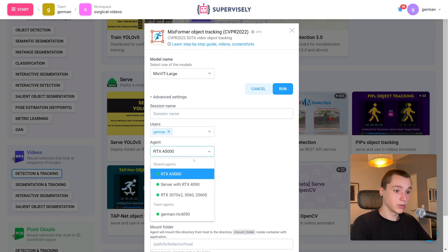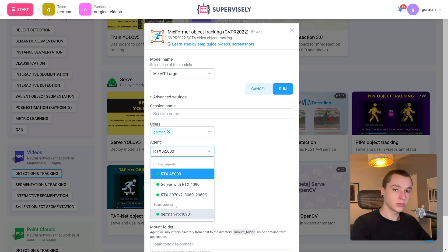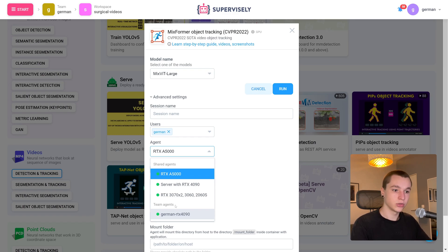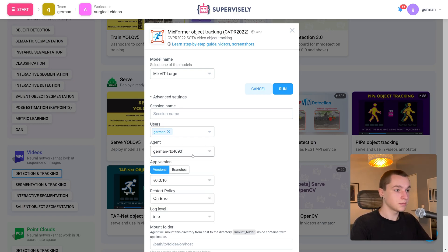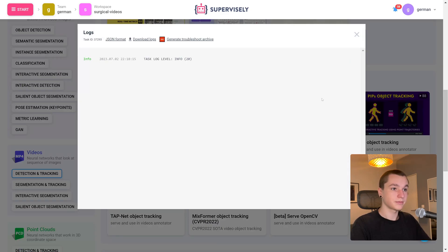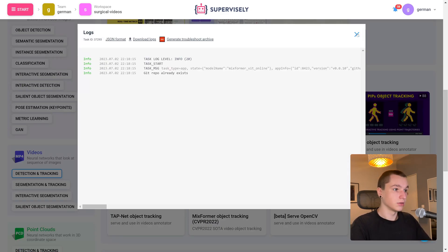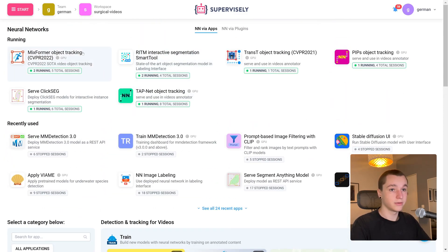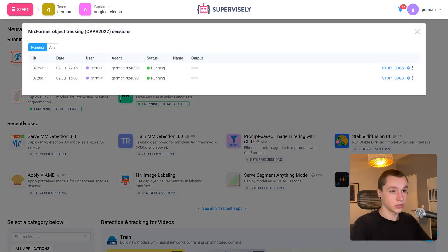If you have several agents connected to your platform, you will need to choose one of them. In my case I have my own computer connected to the platform. I did a tutorial on how to connect your computer to Supervisely — you can watch it on our YouTube channel. Select your desired agent, click Run, then close this window. Just like that, we have MixFormer deployed on our device.